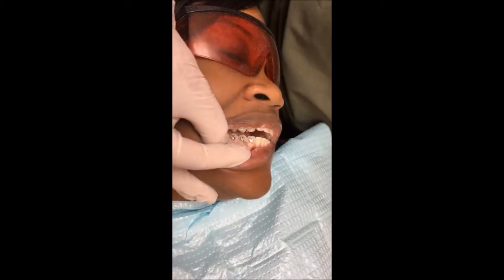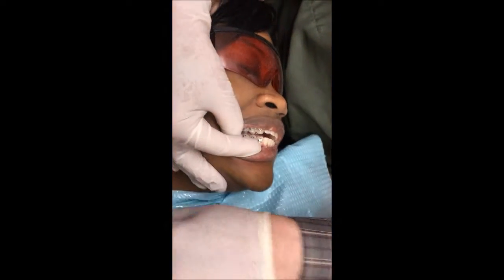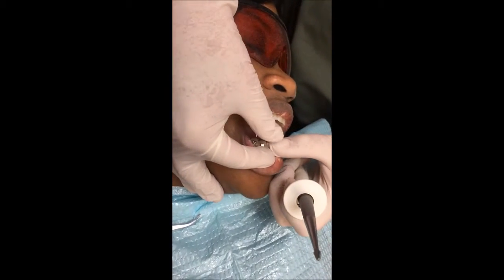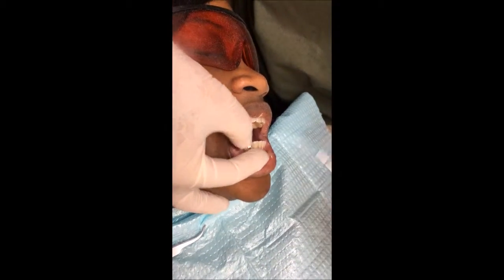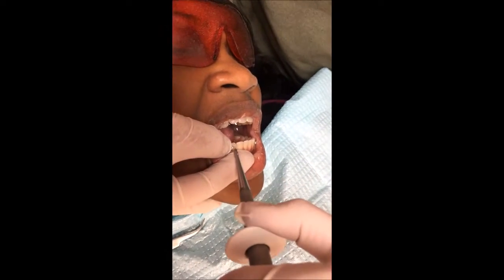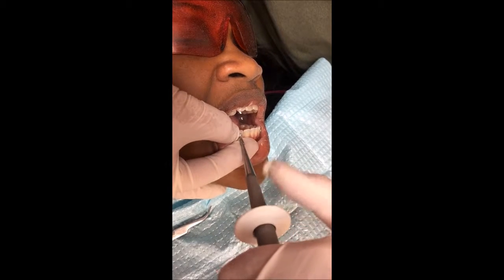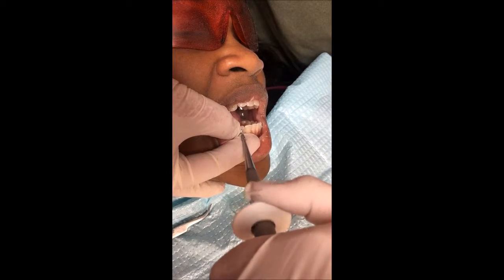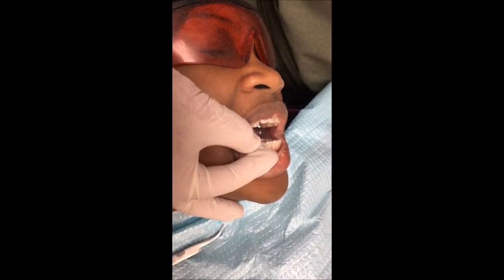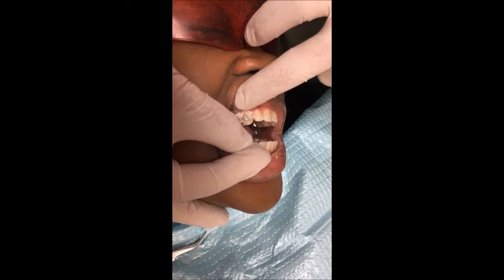And that's done. Voila. This is the instrument that I use if I think that the brackets are going to stick out and bother the patient. I hold the bracket and I tap on the post — especially the canines, because they're in the corner and they can bother the lips. You can see that it's bent in.